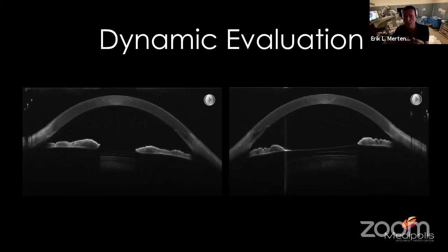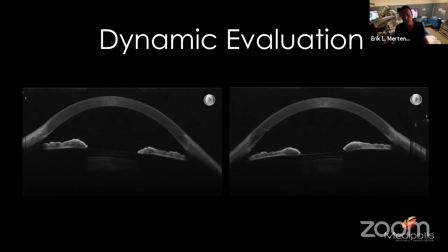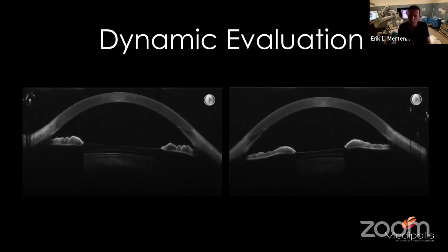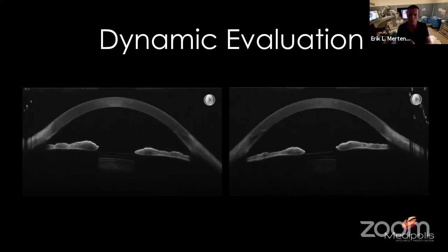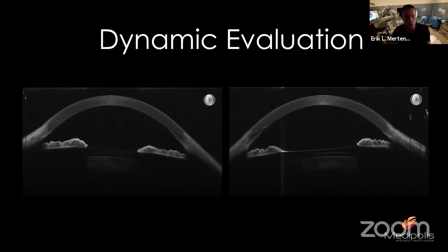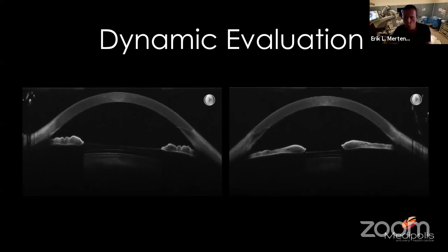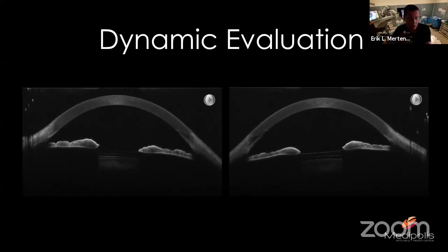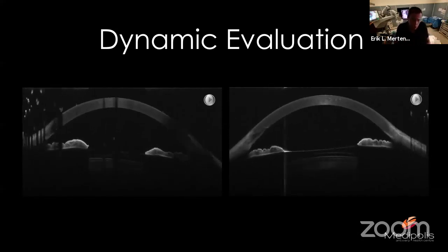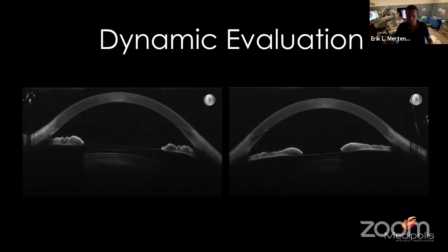The thing is, with the newest version, the Aquaport, from the ICL V4C onwards, it's not a problem anymore to have vaults less than 100 microns. I personally have 23 eyes with vaults less than 100 microns with a follow-up of 5 years with no lens opacities or anterior lens changes whatsoever. So lower vaults with the newer versions of the ICL are not a problem anymore.